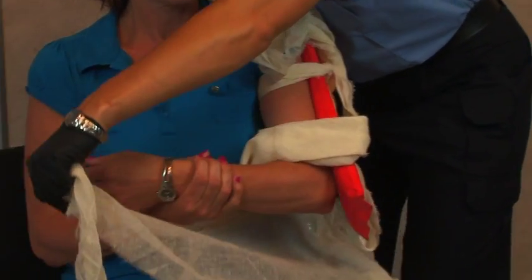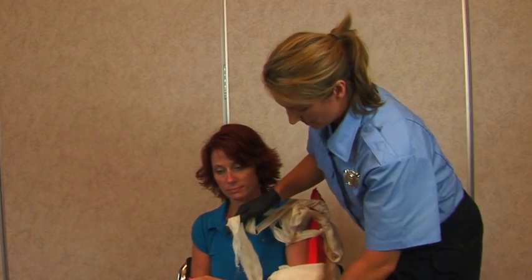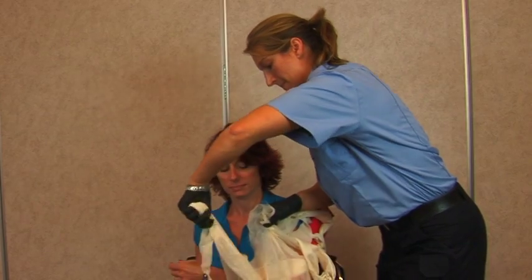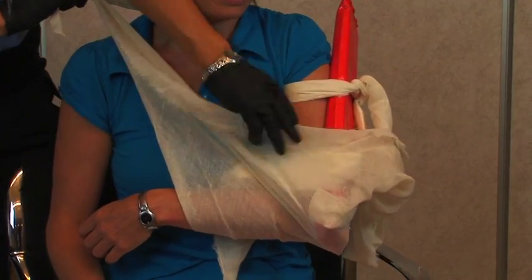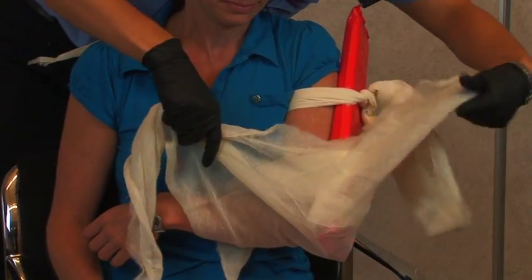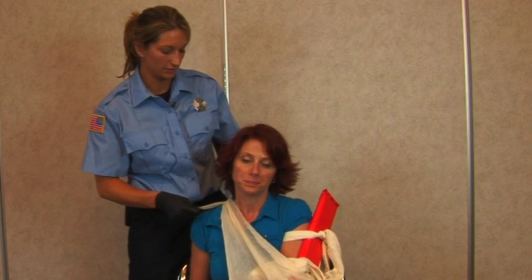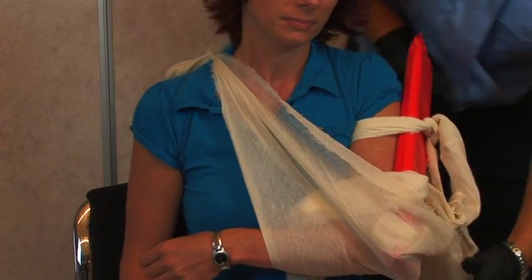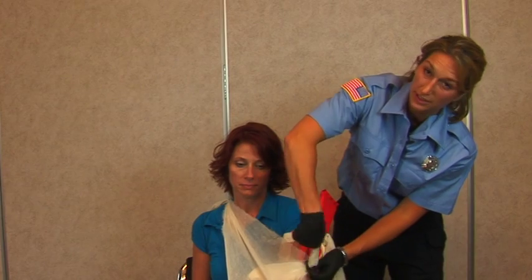You're going to slip this underneath the patient's arm and tie it in the position of comfort. You may need to pad this area. You'll have a little bit of triangular bandage left over on the end near the elbow — you can simply just tie it up like this.